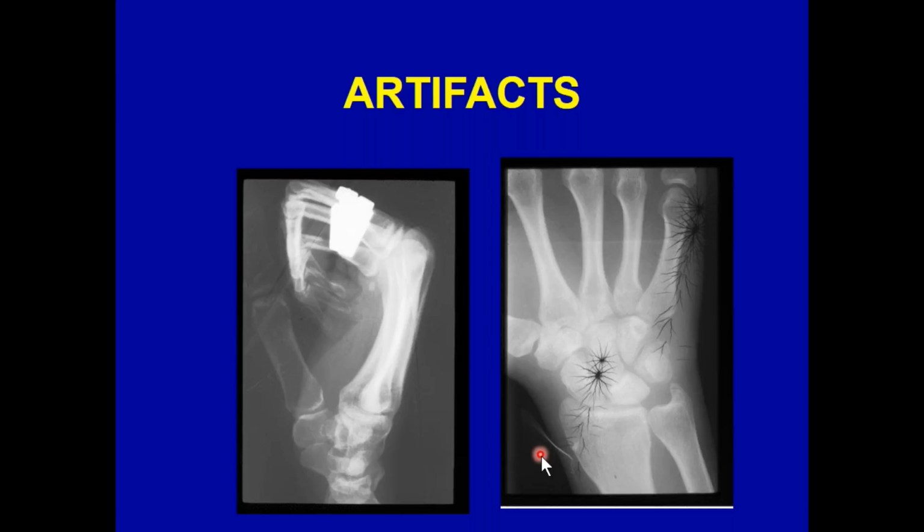All extremity X-rays need to be marked. So if you do that originally, however your system is designed to work, that takes care of that problem. If you collimate to less than film size, you're in good shape, because all you have to do then is put the body part into the area that is lit up, and you don't have to worry about collimation.